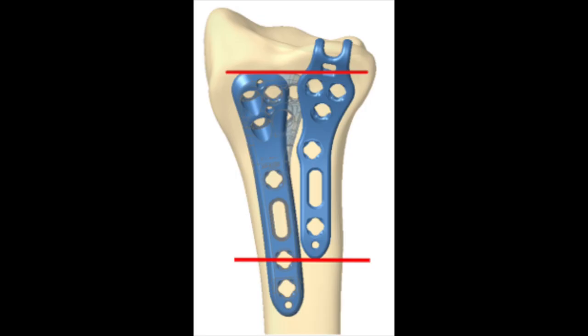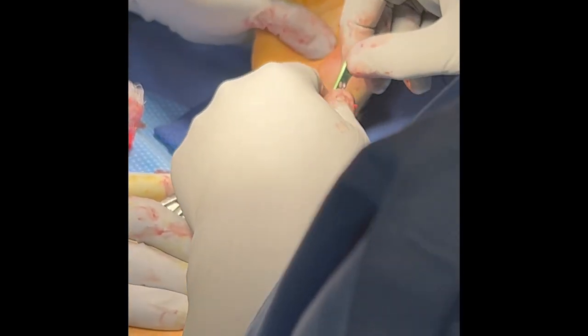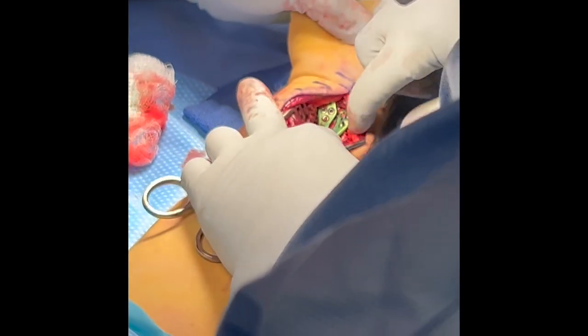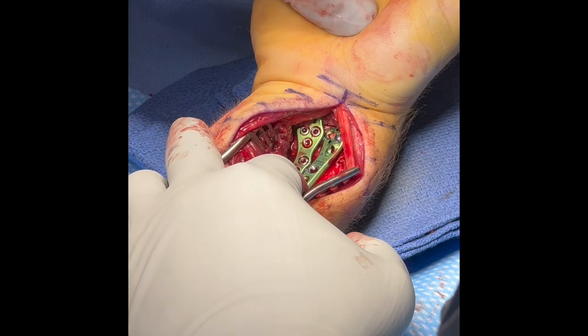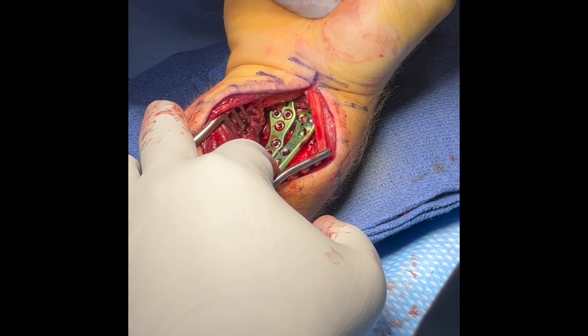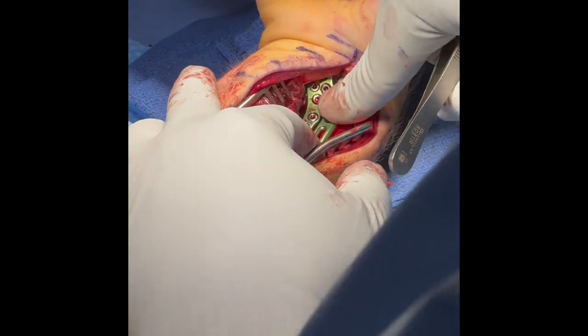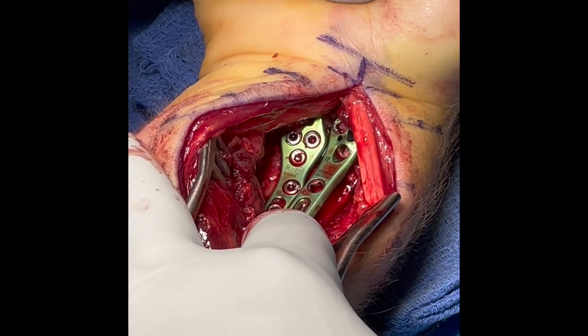The radial styloid plate is placed at the level of the distal screw holes of the lunate hook plate. Two plate options are available; in this case, the narrow plate was selected. The plate finds its position and sits onto the radial styloid fragment.